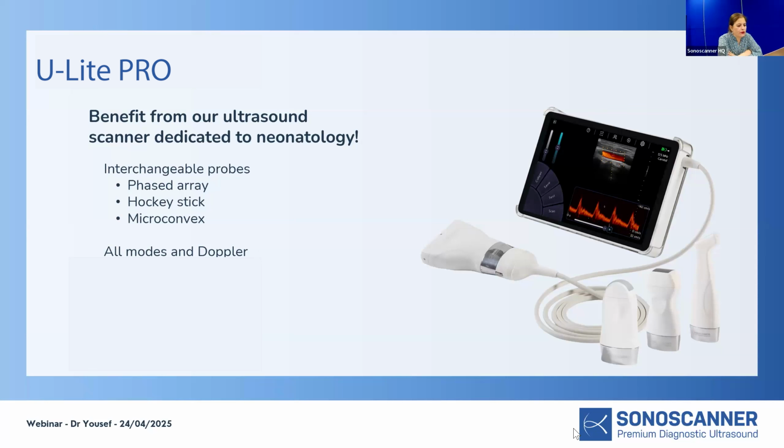Another question is, how could we use lung ultrasound for extubation? Yeah, I also wonder about that. I think it's very interesting to do a scan before you want to extubate, but using a specific score to say yes or no, I think today is much more complicated. The decision to extubate is based on multiple factors. It depends on who your patient is, why the patient has been intubated, and so on. But if you have a lung that's completely de-recruited, with multiple consolidations, not really well aerated, on settings that the baby will probably have after extubation, it doesn't look that good, right?